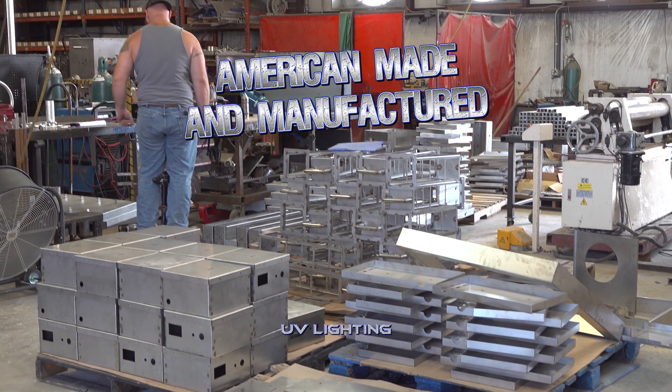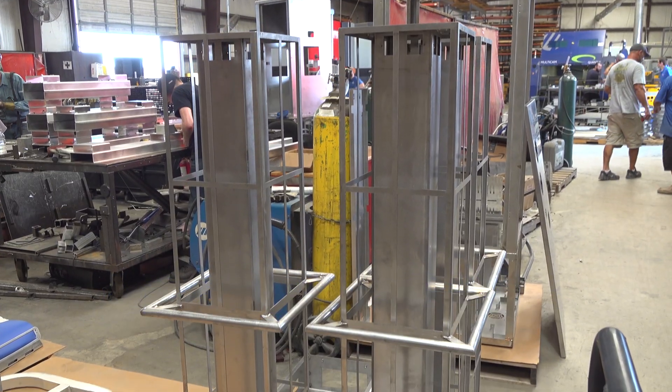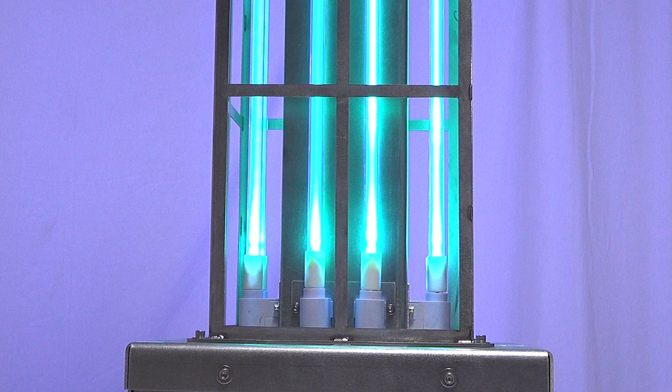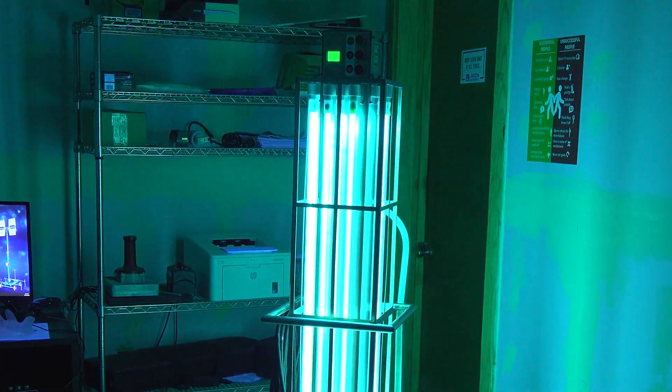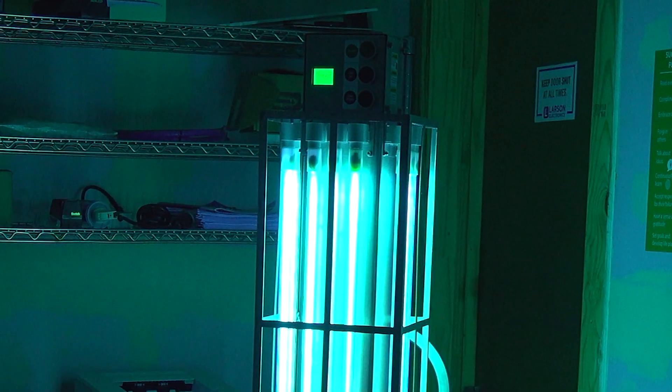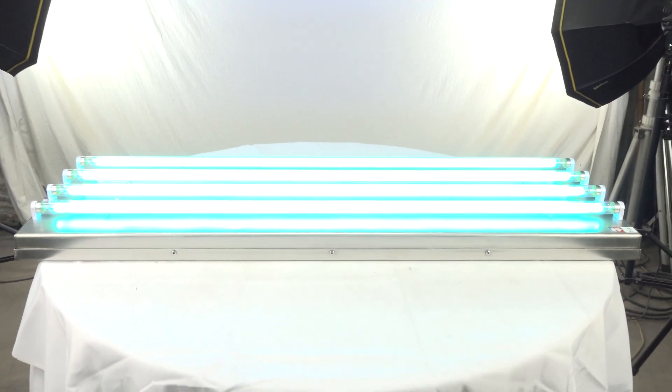All of our UV lighting products are made and manufactured right here at Larson Electronics. Each light offers a UV range of 200 nanometers to 280 nanometers, which is the effective range that can disinfect and kill 99% of viruses, bacteria, mold, and spores on surfaces.